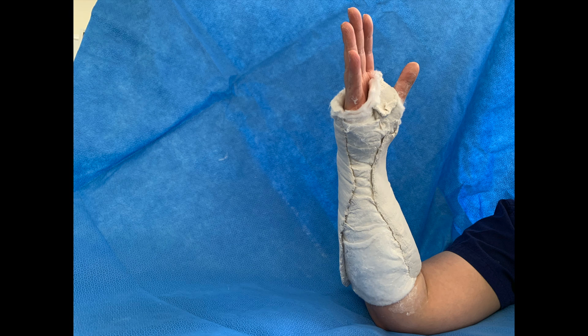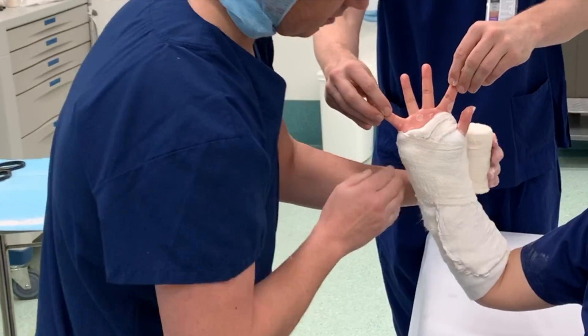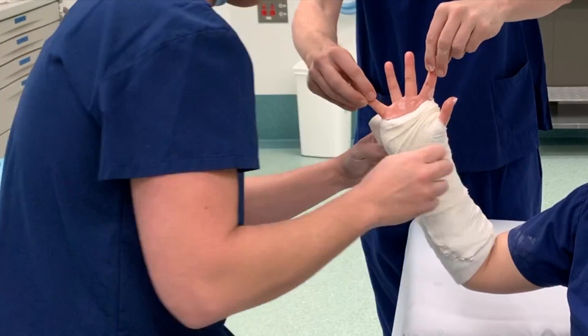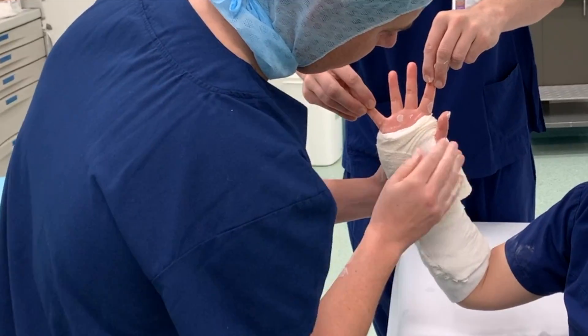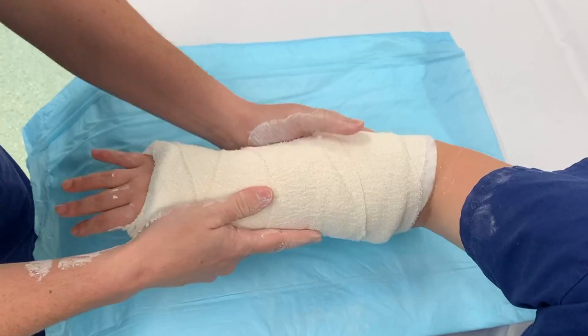There should be an adequate gap volarly without any plaster. To achieve optimal positioning, we mould the plaster to slight ulnar deviation and slight palmar flexion. We then wrap 10cm sized crepe bandaging around the plaster and secure with tape.